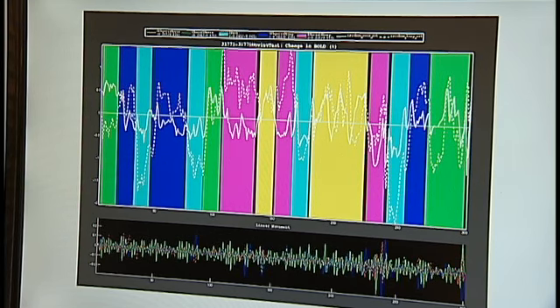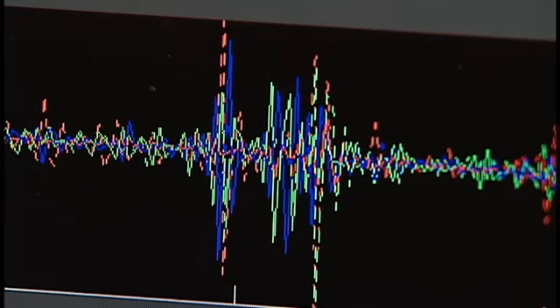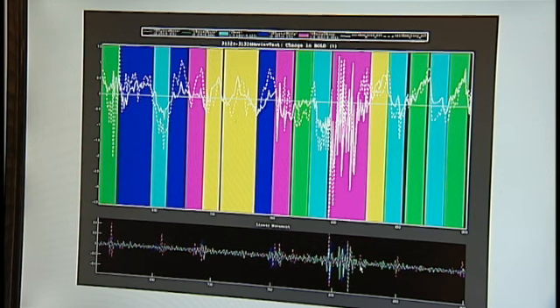This allows us to check that the timing of the psychological paradigm, which we take from ePrime data output files, is properly aligned with the scanner data. The graph below the rainbow plot shows movement. This is a participant who moves a lot, and we can see that periods of high movement often correlate with noisy BOLD signal.